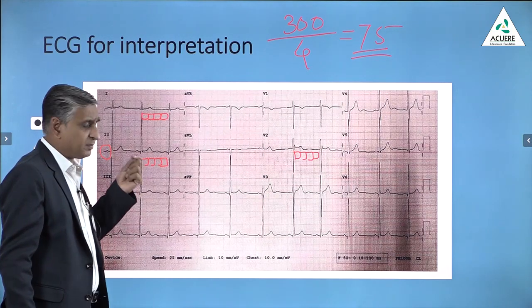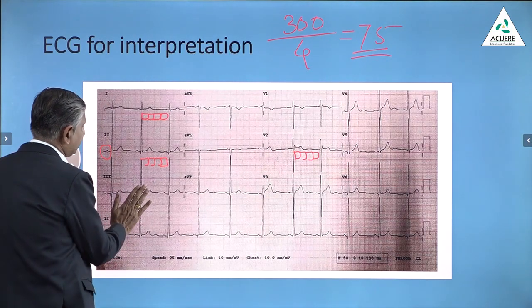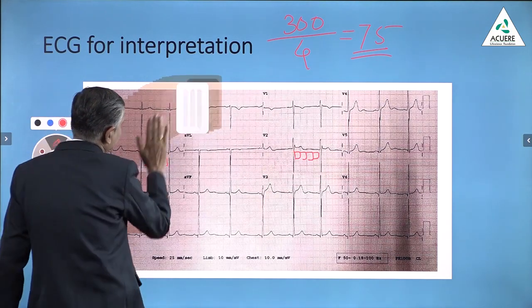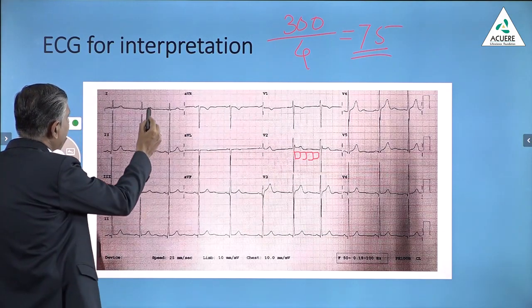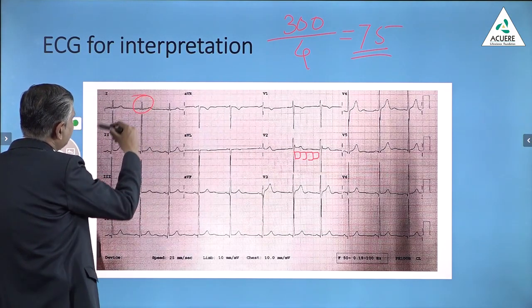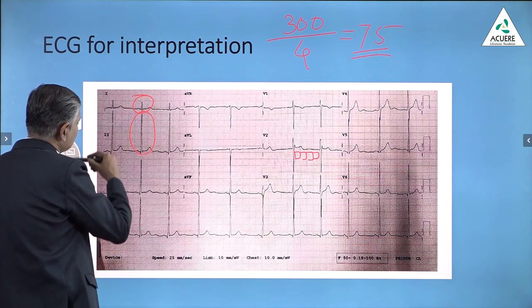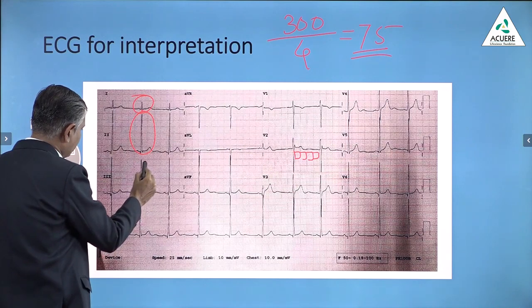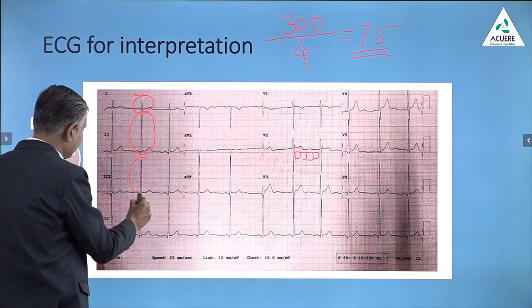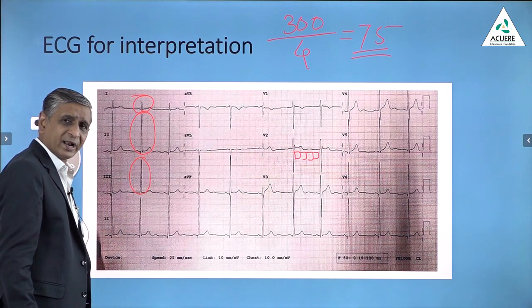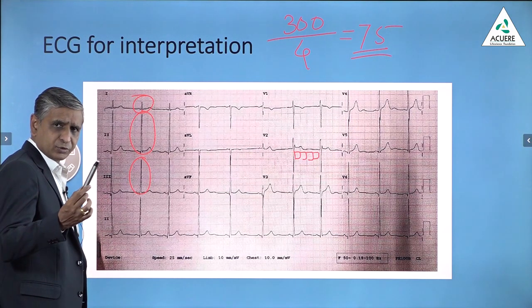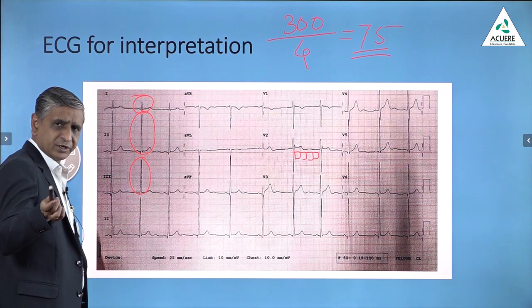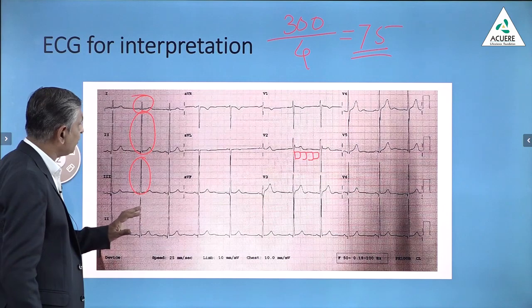Then sinus rhythm, normal heart rate. The third thing I always tell you is the axis. Lead 1 is positive, lead 2 is also positive, lead 3 is also positive — all are positive. Axis is normal.